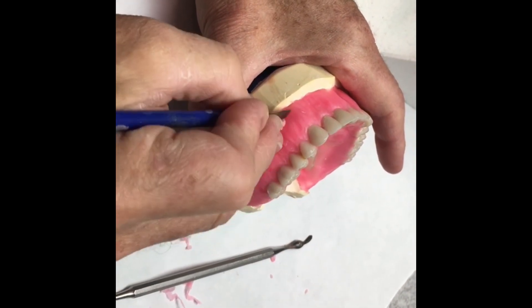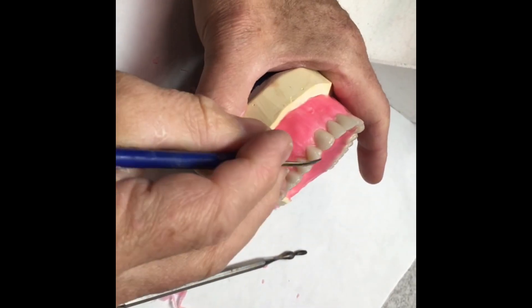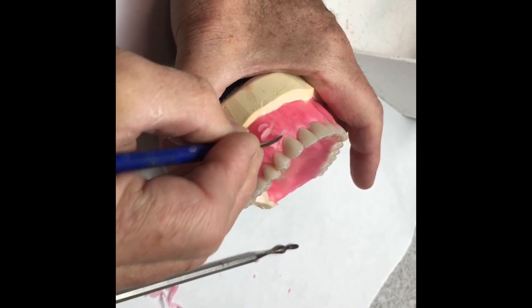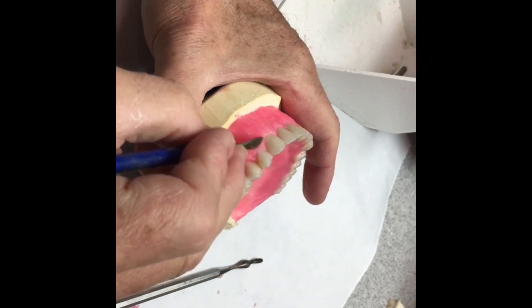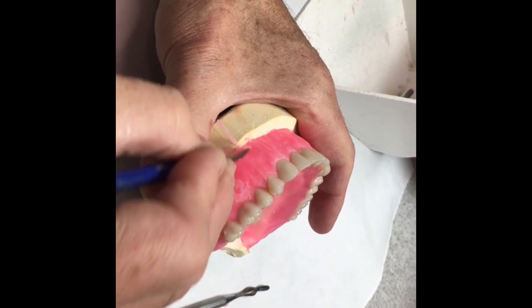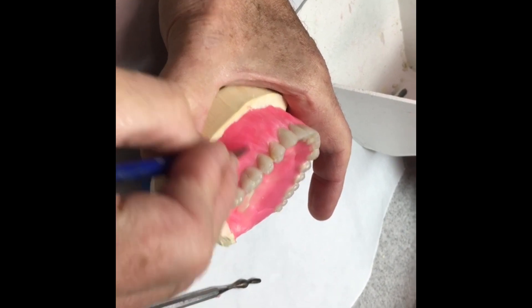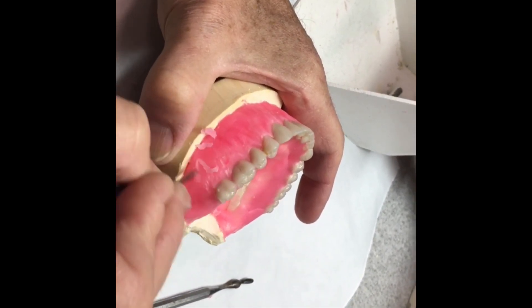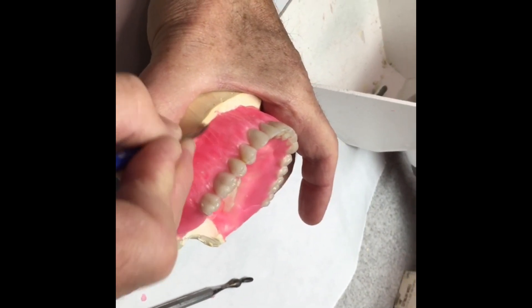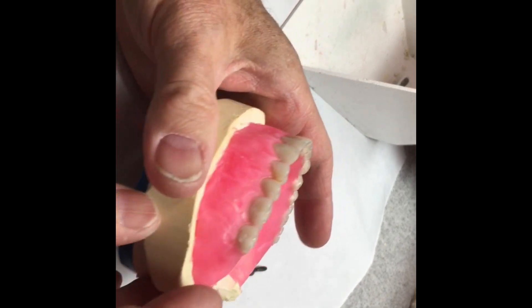The canine eminence is going to be the largest. This particular case is an immediate denture, so the ridge has not resorbed, which is taking up a lot of our space. We can't add a lot of bulk. The denture is going to be fairly thin because the ridge hasn't resorbed. So if you start seeing a yellow cast through the wax, you know you're getting too thin and you'll need to add more wax. This is the case here — pretty large ridges that have not yet resorbed.